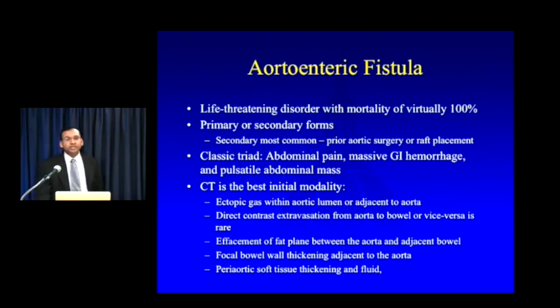Now, the other diagnosis I want you to think about in patients who come into the hospital with lower GI bleeding but are acutely, life-threateningly ill is an aortoenteric fistula. This is a rare diagnosis, but one that, if you don't make the diagnosis appropriately, will kill the patient. Even if you do make the diagnosis, admittedly, these patients have sky-high mortality rates that may approach 100% even with treatment, but any chance they have will be contingent on you making the diagnosis on a CT scan.